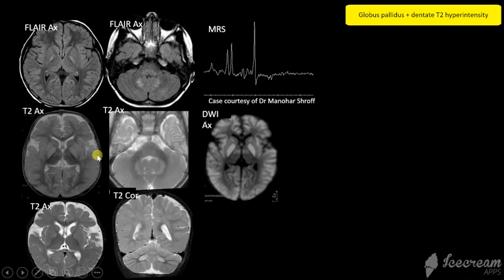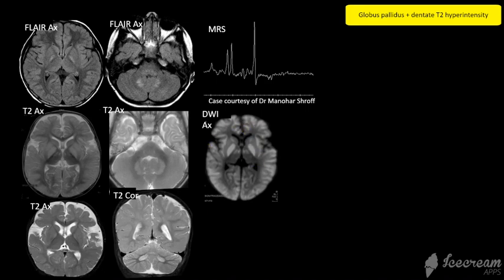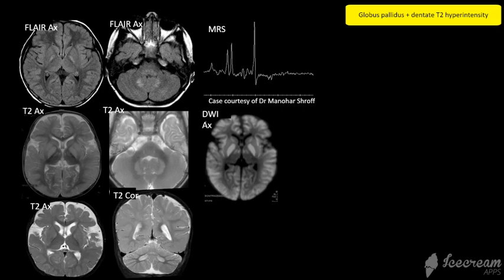The second case has striatal hyperintensity, again very symmetric, looks like a metabolic process, as well as diffuse restricted diffusion. Striatal involvement should make you think of an organic acidemia, and this was propionic acidemia.